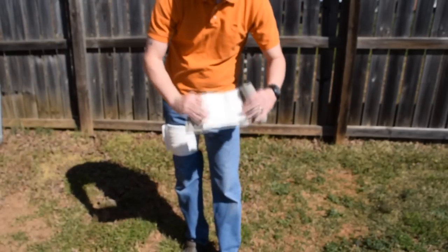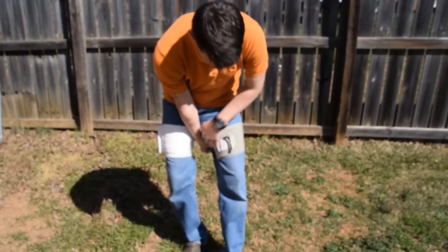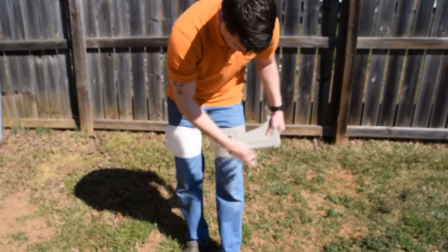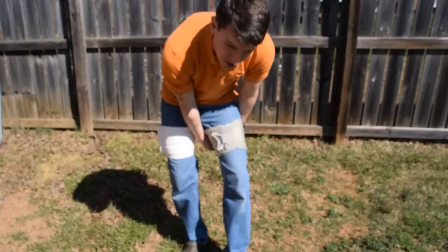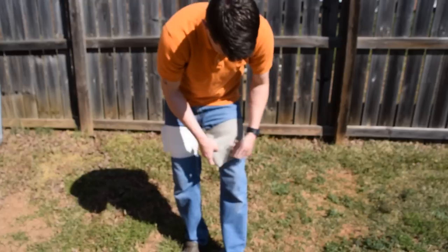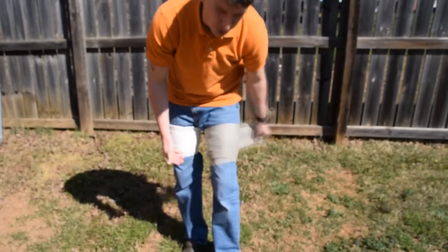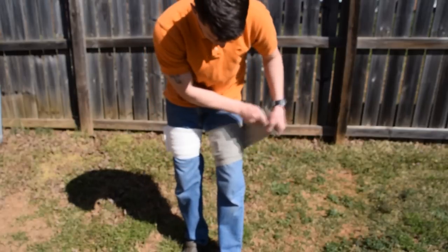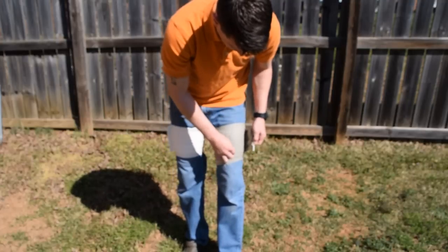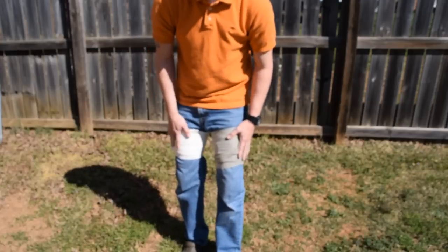With the Israeli bandage it's the same thing — wound on this side. This is the big difference: you've got this bracket that you have to come through and then pull back to generate that pressure. Pull back, now you can wrap it. As you come around, pull to get some more pressure. The Israeli bandage has a clip, so you find your last strand, run it through, and clip it into place to secure it. Now both bandages are secure.